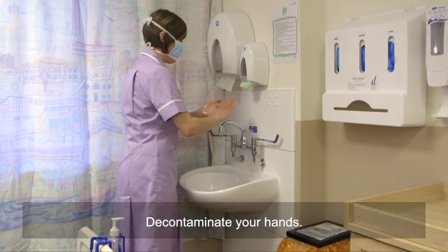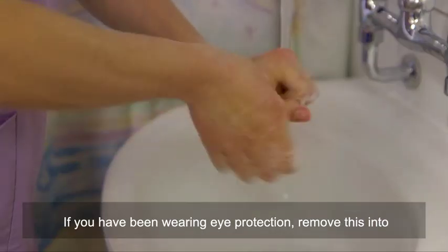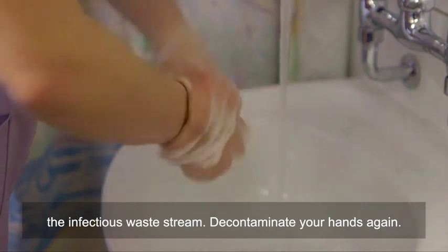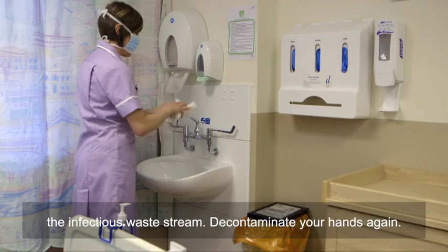Decontaminate your hands. If you have been wearing eye protection, remove this into the infectious waste stream. Decontaminate your hands again.